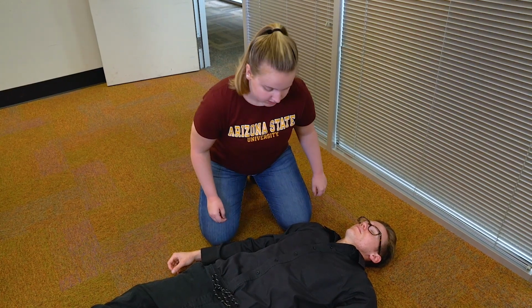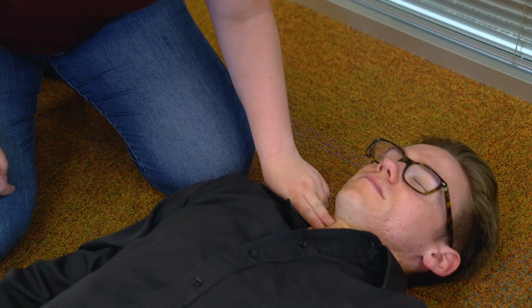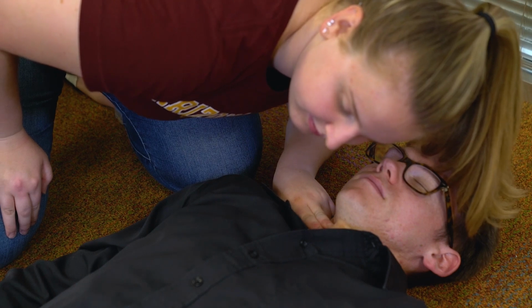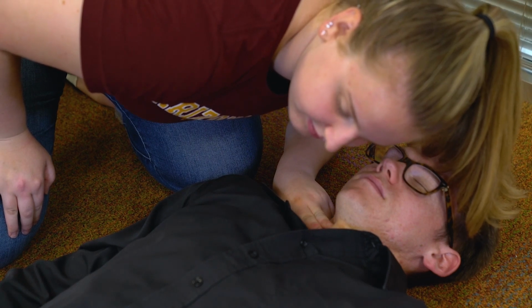Check for absent or abnormal breathing by watching the victim's chest rise and fall. Simultaneously, check the carotid pulse by placing your index and middle fingers on the person's neck to the side of their windpipe. If the victim has a pulse and is breathing, monitor them until emergency responders arrive. If the victim does not have a pulse and is not breathing, begin chest compressions.